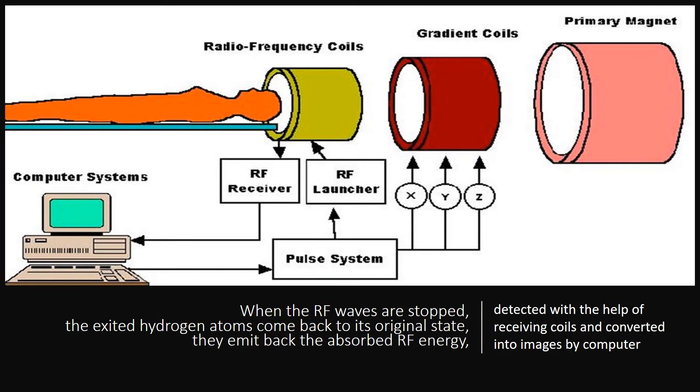When the RF waves are stopped, the excited hydrogen atoms come back to their original state. They emit back the absorbed RF energy, which can be detected with the help of receiving coils and converted into images by computer.